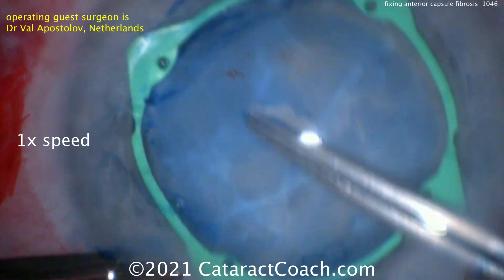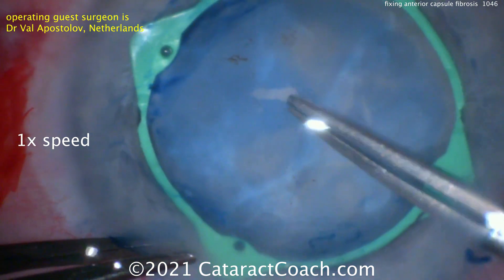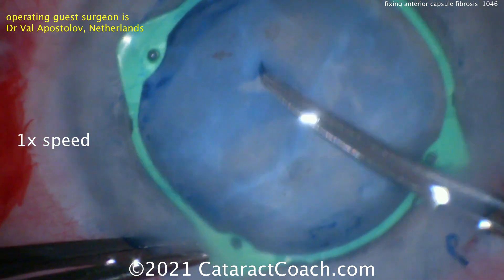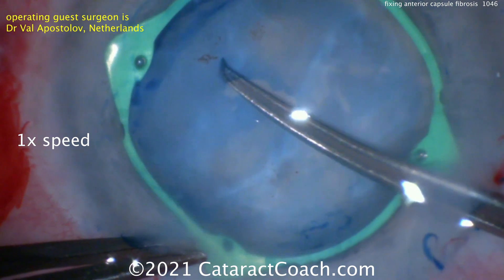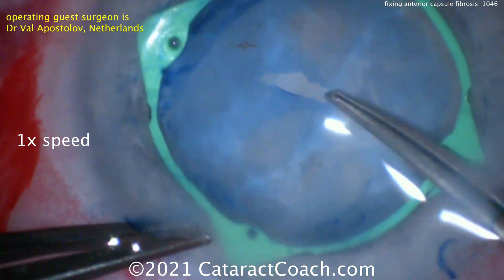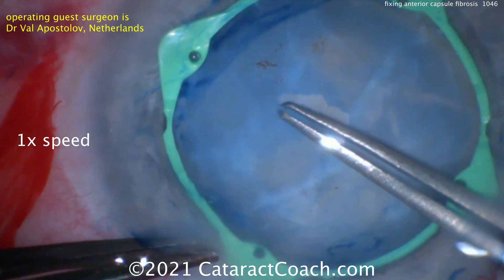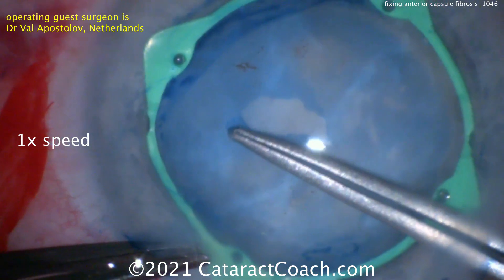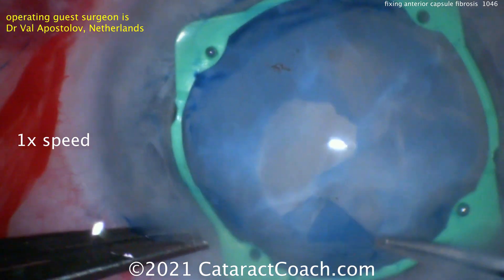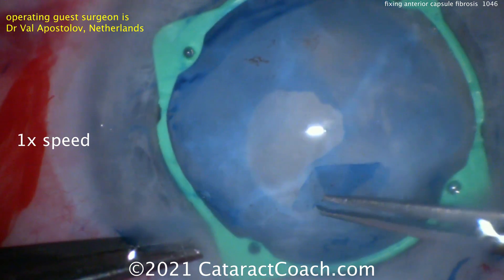He starts with his forceps, doing a little bit of rhexis, but what he really wants to do is get under that capsule and separate the undersurface of the anterior lens capsule from the fibrotic anterior cortical area. By doing this separation, he actually breaks all the adhesions. It's a different approach — starting centrally and then moving out peripherally — which makes it a lot easier to break those adhesions.